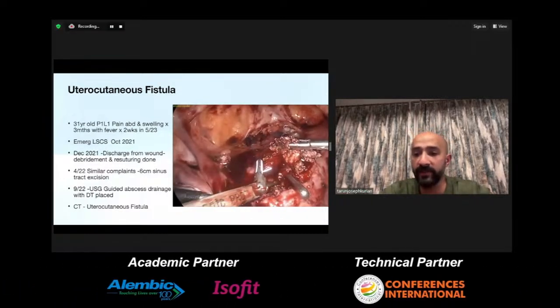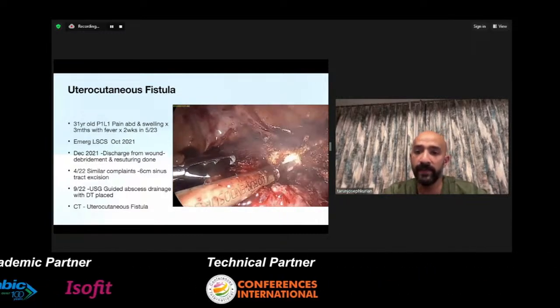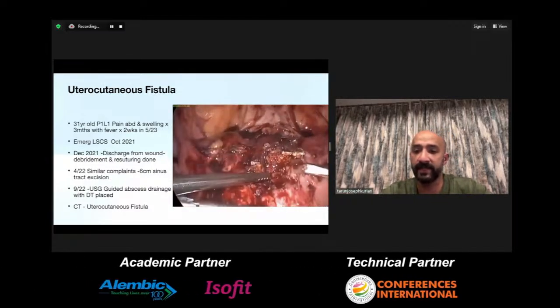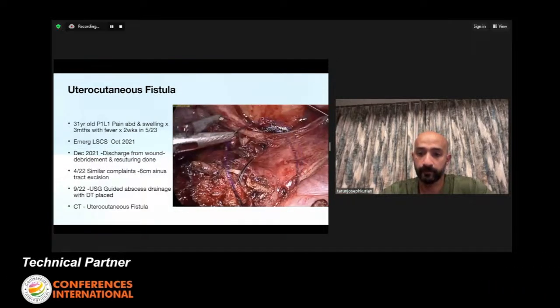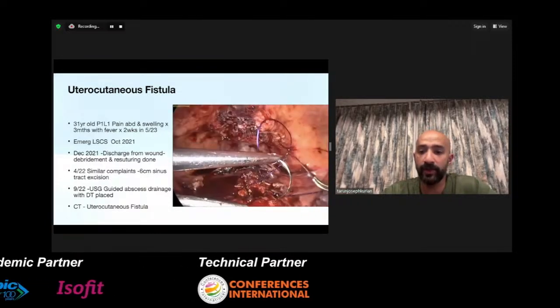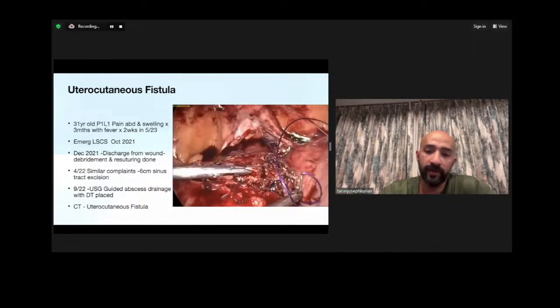So once you know where the fistulous tract is, again, our procedure becomes quite simple. We didn't really require any vasopressin for this case. We just went ahead, excised the entire tract, and sutured the entire thing closed. Since this lady was planning further fertility, we sutured this in 2 layers to make sure that there is no further defect.